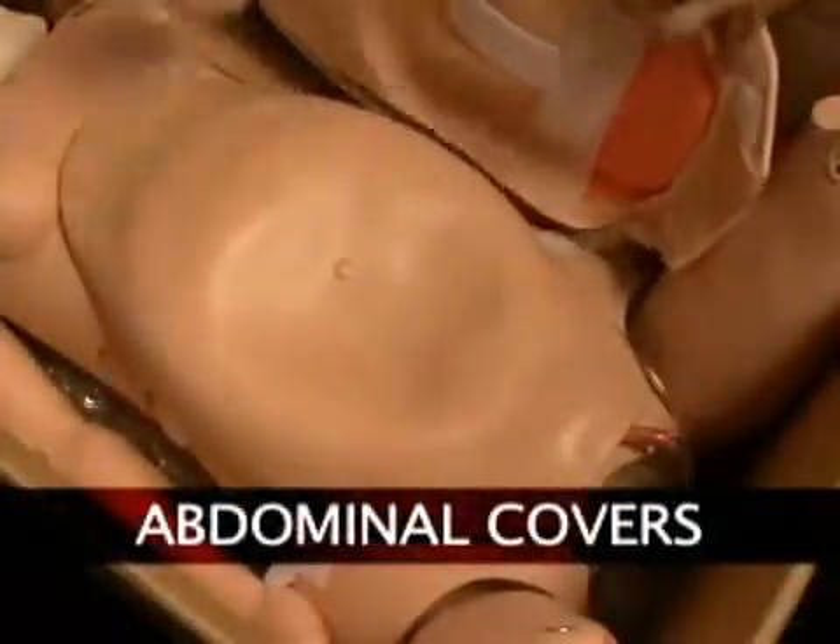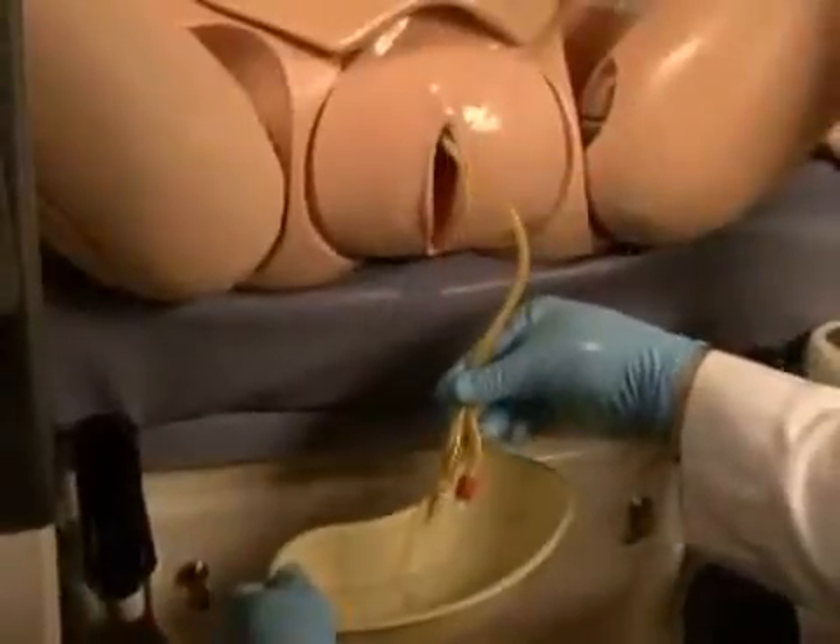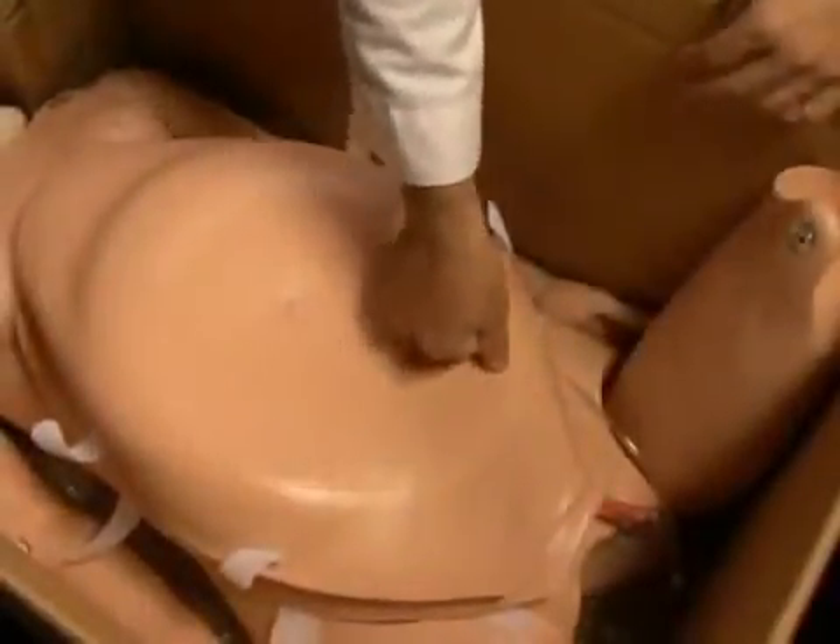You have received two abdominal covers. One is equipped with a urinary bladder, which can be catheterized and drained of fluid. The other is the C-section abdominal cover.